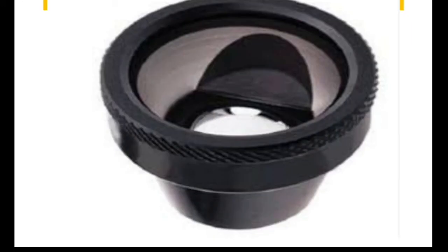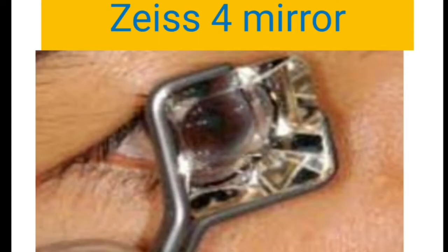One more difference between the Goldmann lenses and the ZEISS 4 mirror is the area of contact of the posterior border over the cornea. In the Goldmann lens it is almost covering the cornea, almost to the limbus. With the ZEISS 4 mirror, the area of contact is less. It is just touching some part of the cornea. So that is helpful when you are doing indentation gonioscopy.